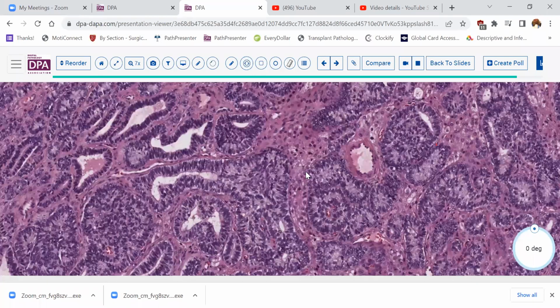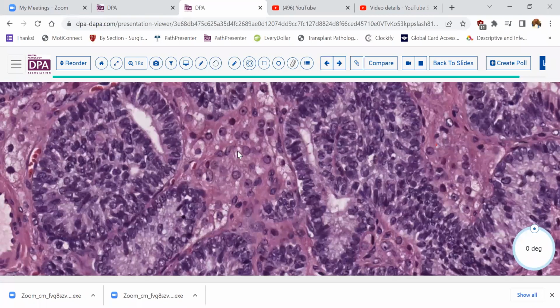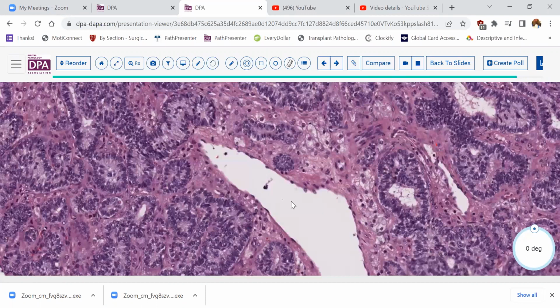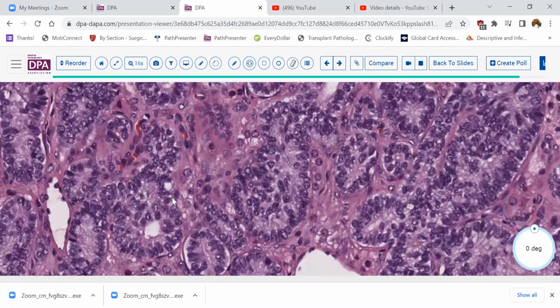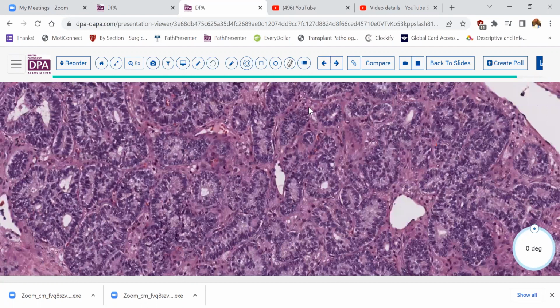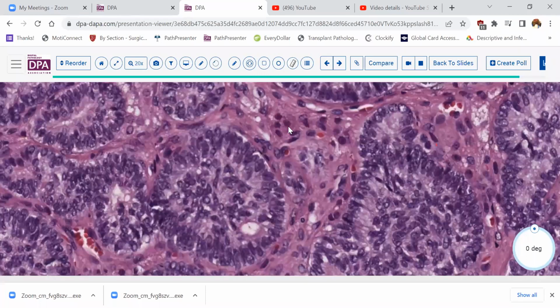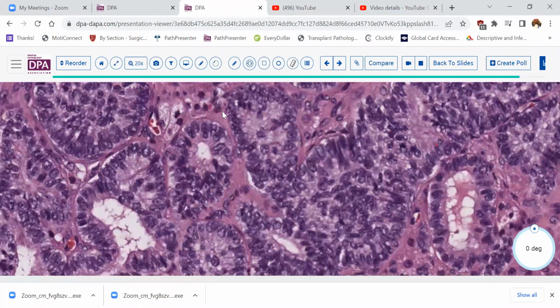But of course, I've been glossing over the other feature here, which as we look at the intervening stroma, we see there are a number of these nicely rounded cells with fairly abundant eosinophilic cytoplasm. And these would fit fairly well for Leydig cells. Here you can see there's quite a few of them in this case, and they're much more admixed with this tumor than they often are. Sometimes they tend to be very focal in certain of these well-differentiated tumors. But there's certainly plenty of them here, and recognizing them, you can go on a search for crystalloids of Reinke. You may or may not find them. For example, right there, I think you've got a couple that could qualify in that category.